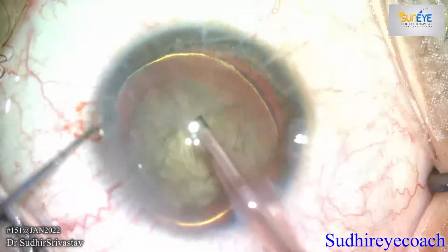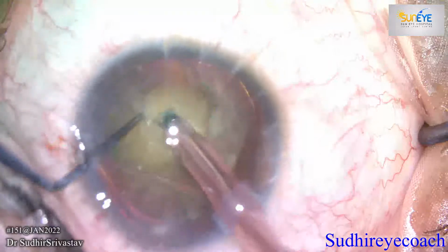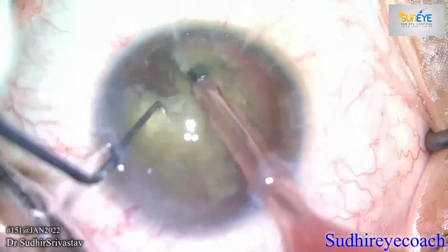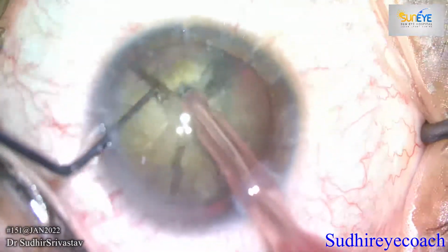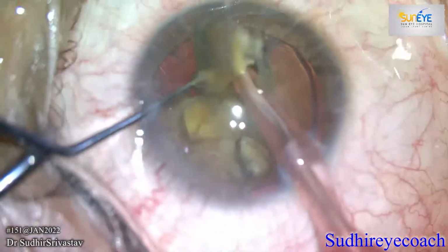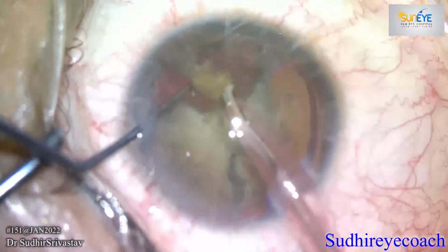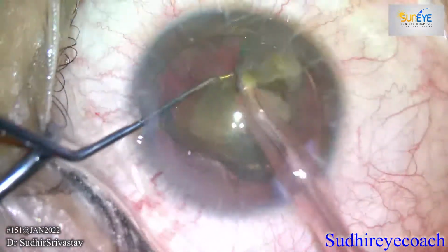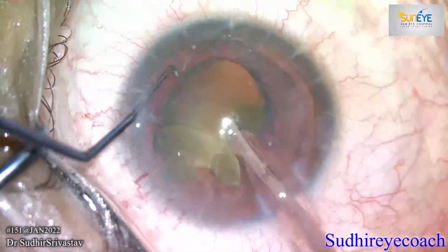If you are getting proper sight of a clear corneal incision, you can make it between two radial keratotomy incisions. However, clear corneal incisions made too close to radial keratotomy or too central are at a higher risk of inducing irregular astigmatism, possible worsening of aberrations and loss of structural integrity if they cross the radial incisions. The rest of phaco surgery almost remains the same as we do in a normal case.